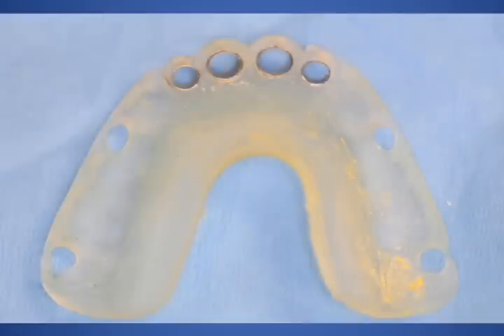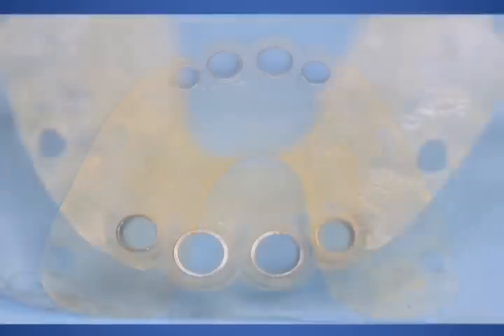But first and foremost, we had to design a surgical guide that would allow us to correctly place the Nobel Biocare Replace Select dental implants in a relatively tight area.